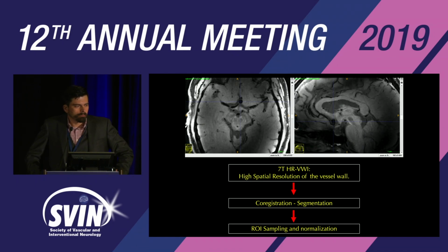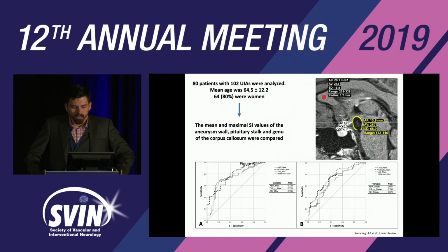And we're trying to automate the whole process. This paper is going to be published soon. We took all the described methods to measure signal intensity and contrast enhancement to give you a real number of what's going on with the aneurysm after you give contrast.